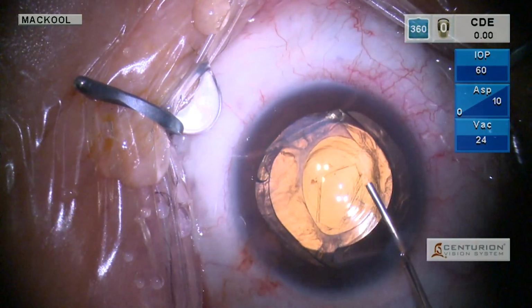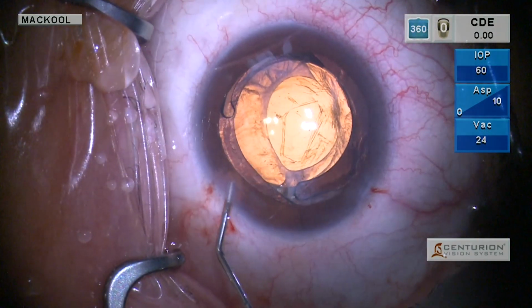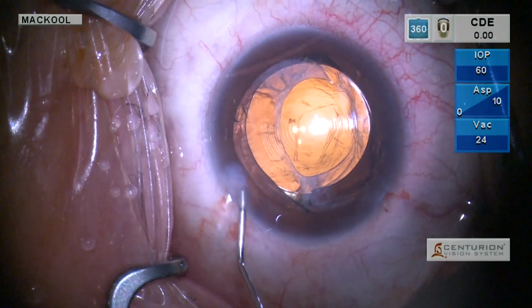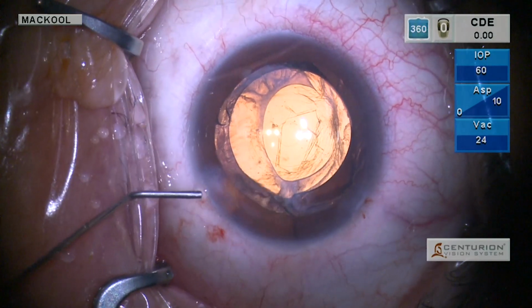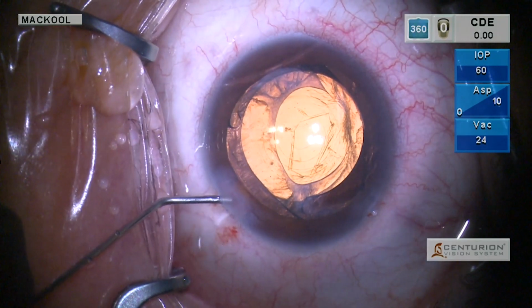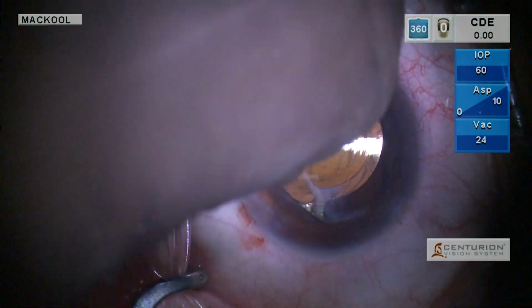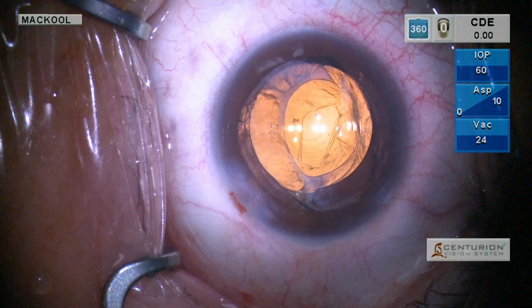But now we've got this lens well centered, and we have, as you can see, multiple central rings now exposed. So hopefully that'll take care of the near vision issue. Now this YAG laser capsulotomy may need to be enlarged, if only because the edges of that capsulotomy are fairly likely to cause nocturnal glare issues because of diffraction of light rays as they hit the edges of that capsule, but that can be easily done down the road here.